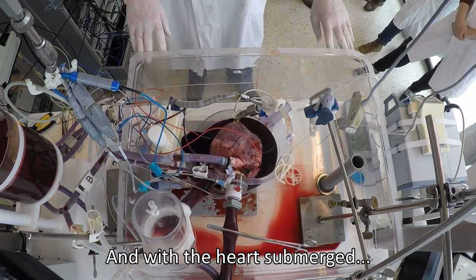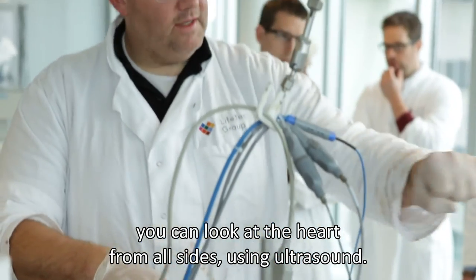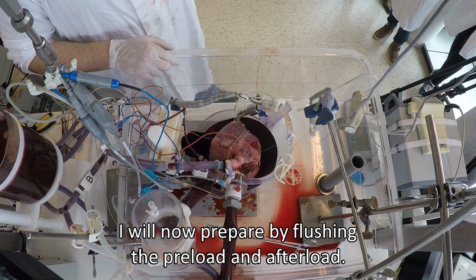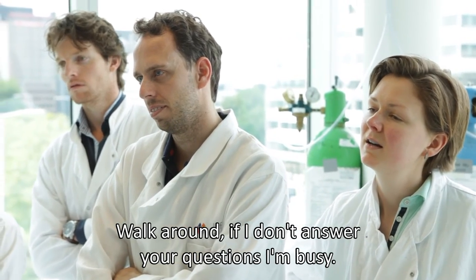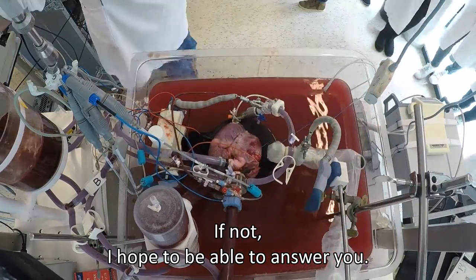I can start and fill this tank completely with water, so the heart is submerged, and then you can perform echo from all sides. I'm going to prepare by flushing the preload and afterload. Then I'll walk you through it and take questions — if there are any, I hope I can provide the answers.